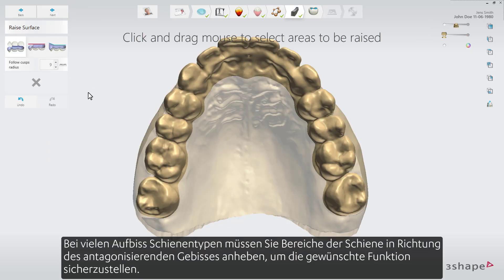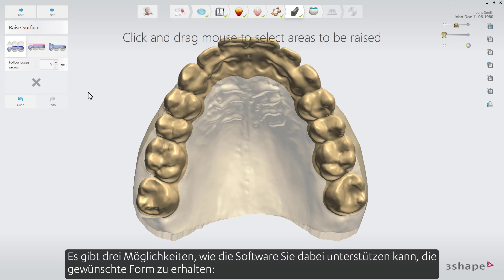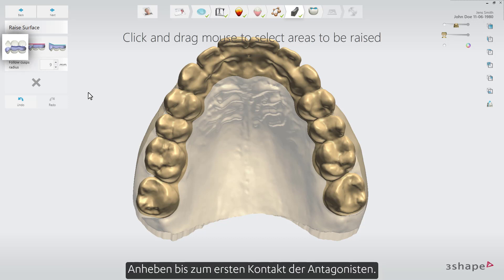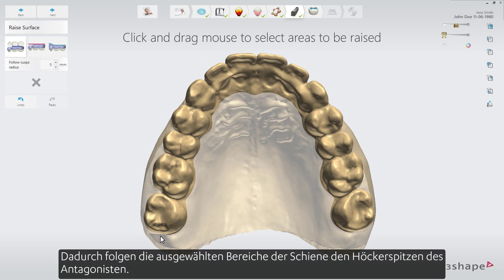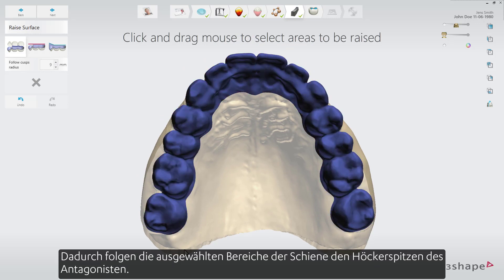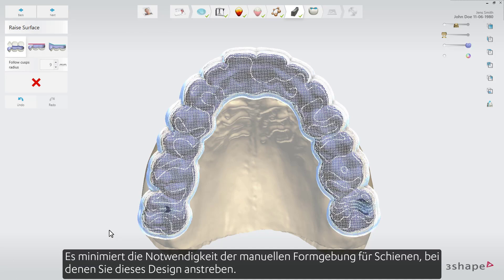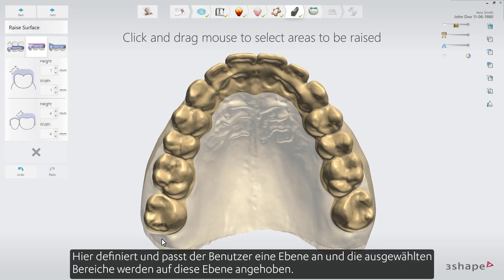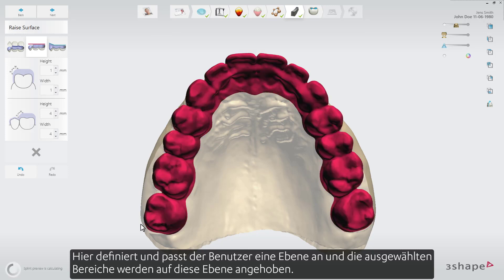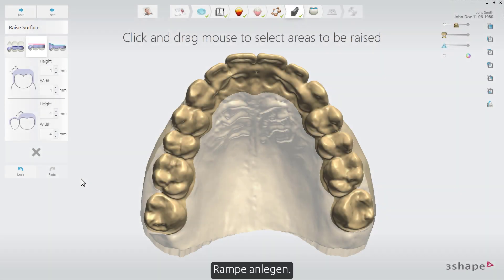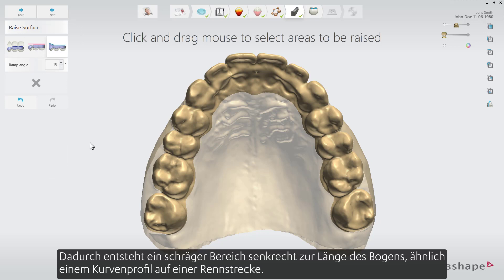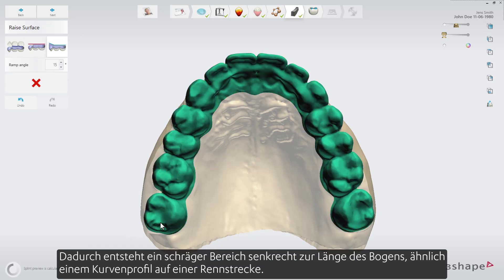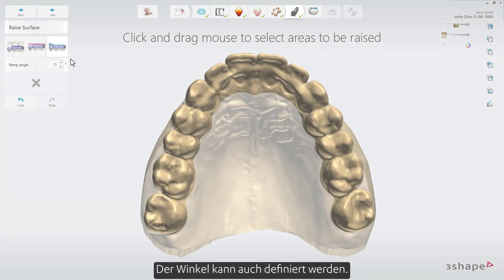In many occlusal splint types you'll need to raise areas of the splint towards the antagonizing dentition to ensure the desired function. There are three ways the software can assist: Raise to antagonist cusp tips — this makes the selected areas of the splint follow the antagonist cusp tips, minimizing the need for manual sculpting. Raise to a plane — the user defines and adjusts the plane and the selected areas will be raised to it. Raise ramp — this creates a slanted area perpendicular to the length of the arch, similar to a turn profile on a racetrack, and the angle can also be defined.